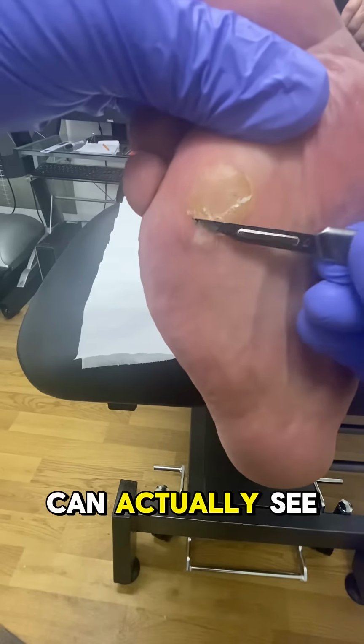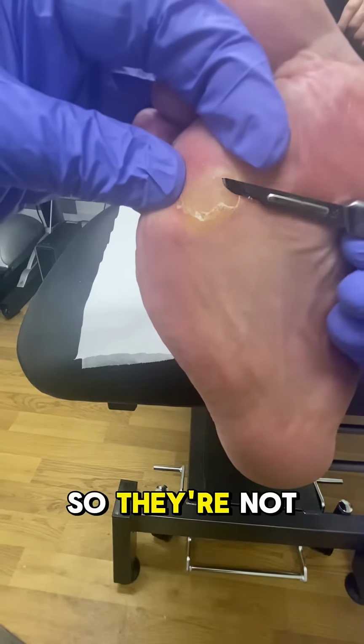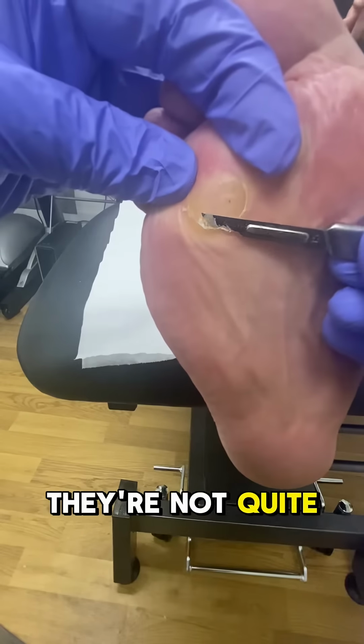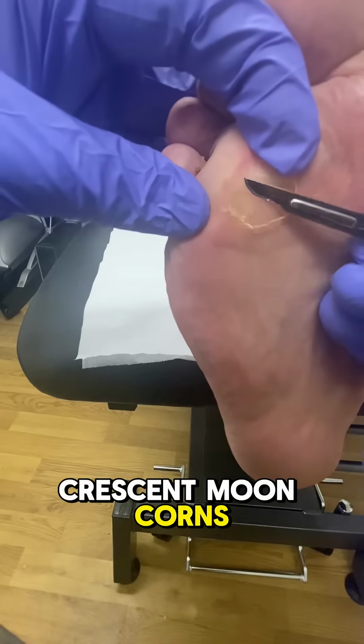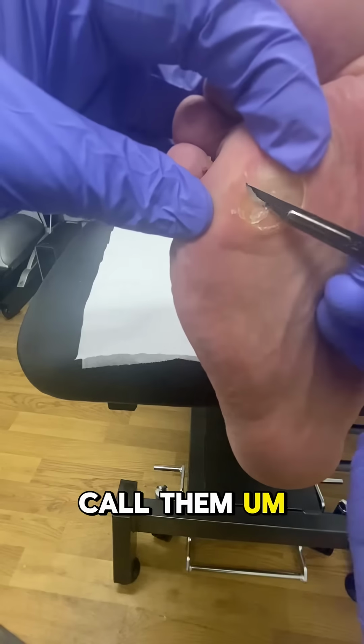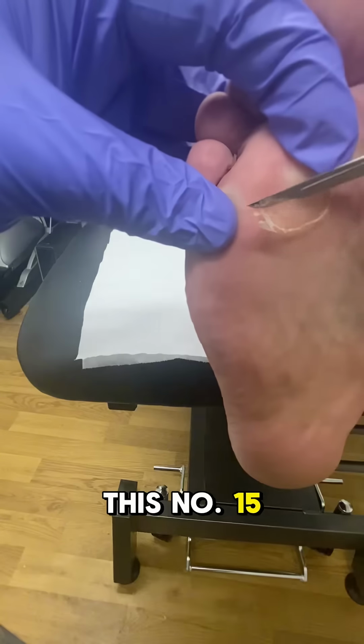And then you can actually see in here, there are these little hardened sections all through it. They're not quite corns, but they're not quite callus either. They're just these hardened little crescent moon corns, I guess you'd call them. So we just go ahead and cut all of those out, being really careful, with this number 15 blade here.